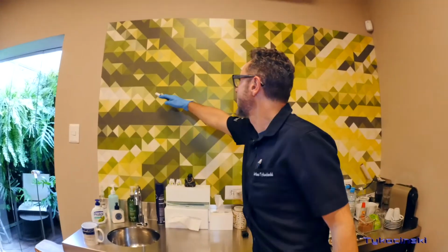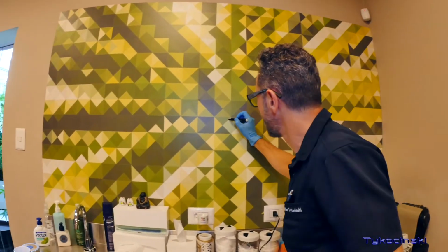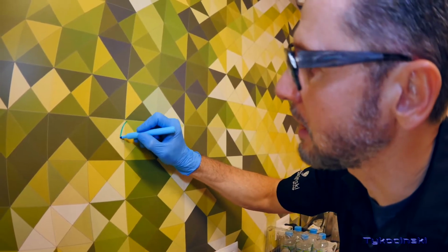Let me introduce you to the donor area. All this is our donor supply, all this composed by individual follicular units, one by one. Okay, let's start the procedure.